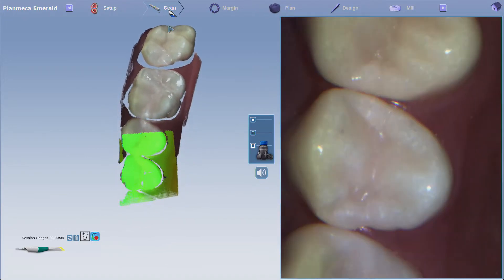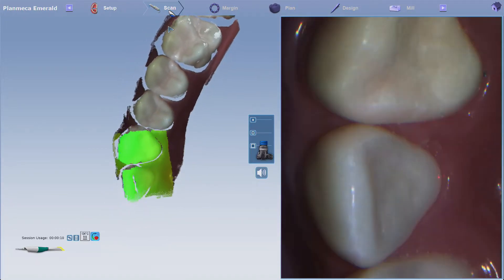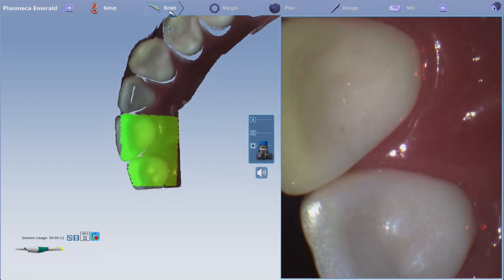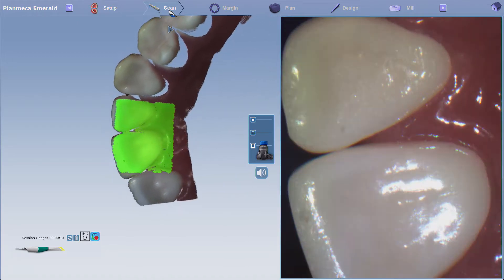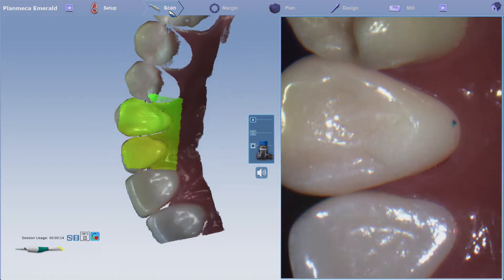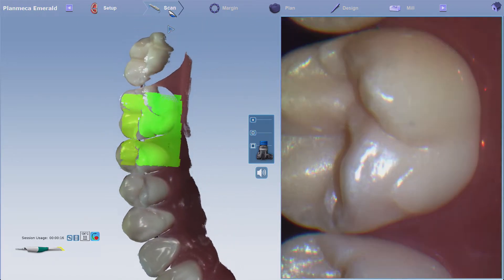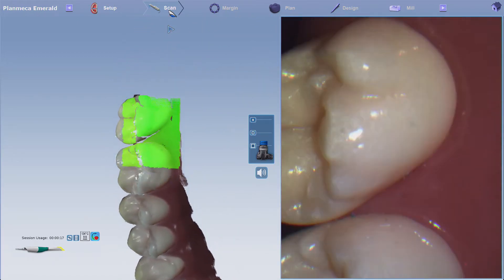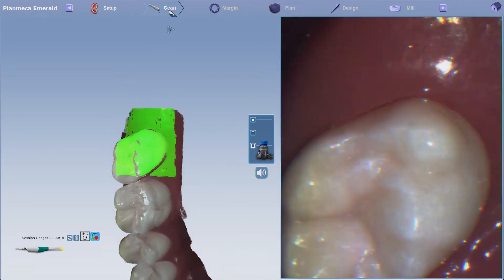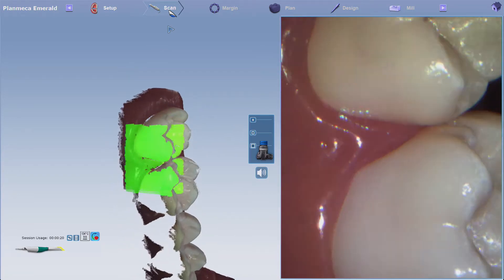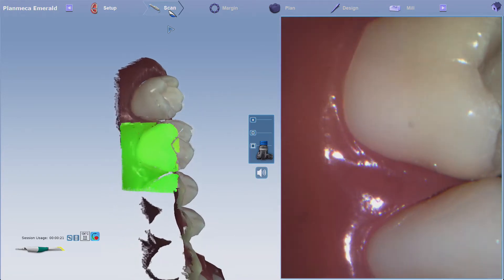Start scanning on the most distal tooth on the occlusal surface, scanning up to the anteriors. Roll to the lingual, capture those surfaces, and then roll over to the buccal once you get to that distal tooth and capture the buccal.